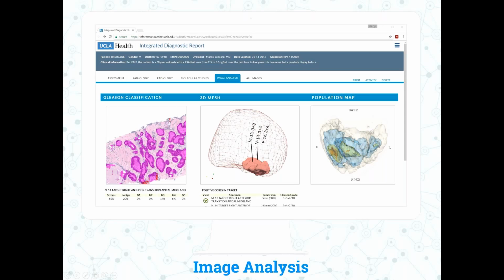We have a population map where we took several hundred prostates from UCLA and registered them, and then created a heat map of where we see cancer here. So you can contextualize the current patient given the population we see at UCLA. Our Gleason classification algorithm isn't live yet, but we're working on it, and it would just do quantification. Here we see a table of the percent stroma, benign, and the various Gleason grades.